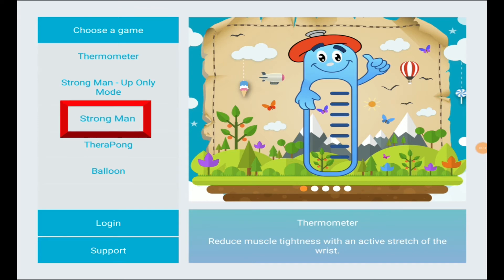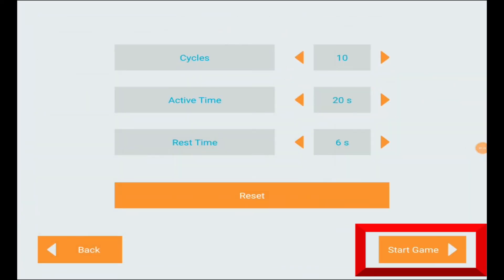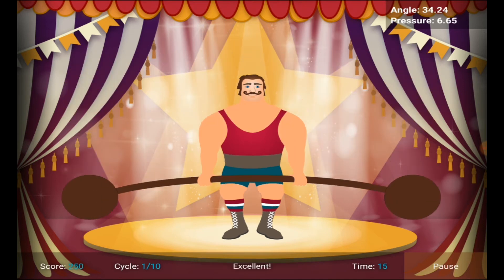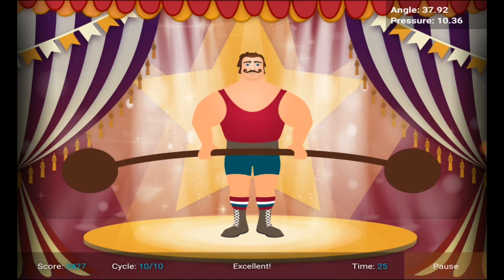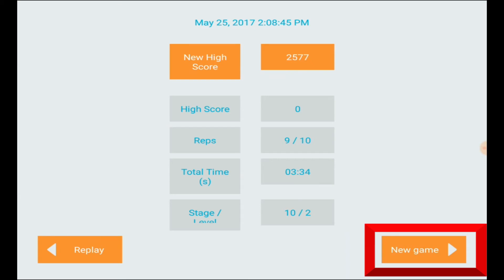Next is the Strongman game. Select it and hit next and start game on the bottom right. First, flex your hand down to pick up the bar — the strongman will move to pick up the barbell. When you see 'good,' lift your hand up toward the ceiling until the barbell is completely over the strongman's head. If you're having trouble reaching your goal, the device will assist and give a 30-second stretch before the next cycle. After completing, you'll see a score screen — hit new game to return to the selection menu.